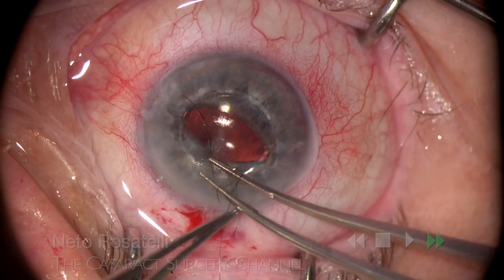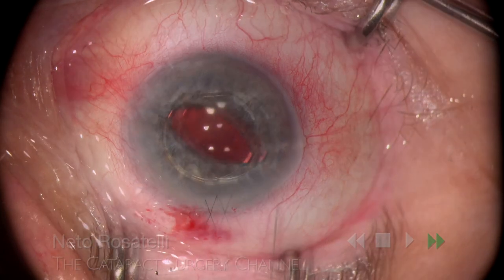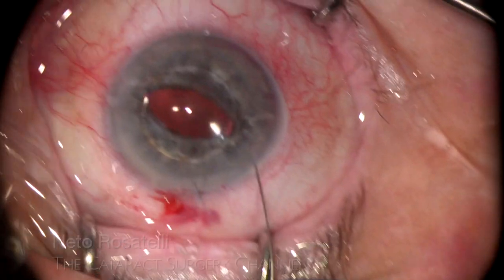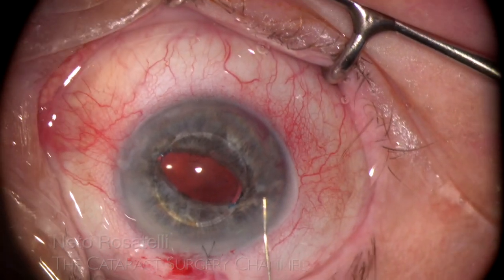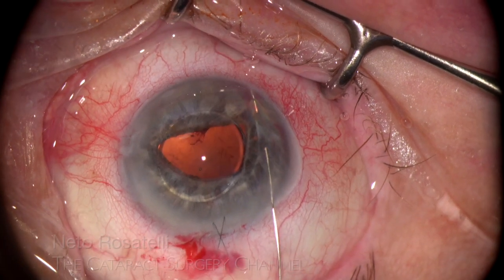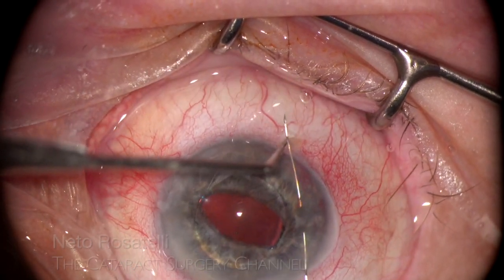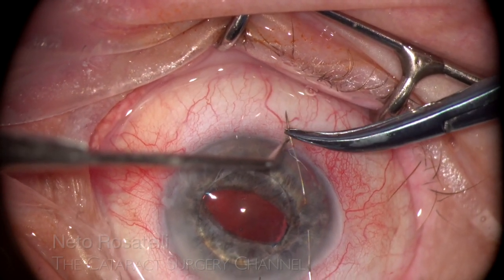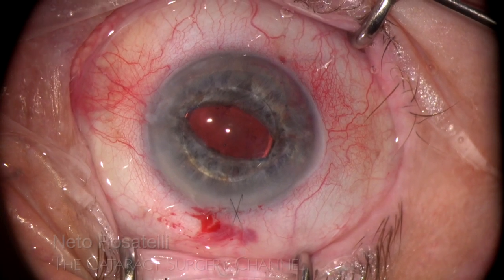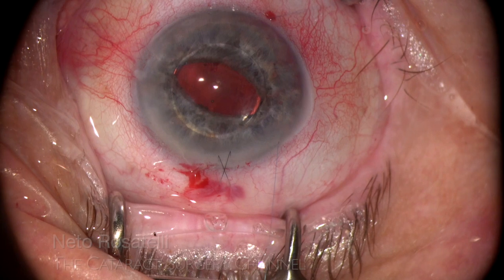Now for the iris fixation. The IOL already is at the intended position. Fixation sutures will be placed at 3 and 9 o'clock. I am passing a 10-0 prolene with a straight needle, going from limbus to limbus and engaging the haptic from behind with a moderate iris bite in its mid-periphery. By tenting up the iris, I check if the bite is adequate and proceed to exit at the limbus, a Kuglen hook helping to stabilize the eye. These placement landmarks are very important to ensure good IOL centration and a round and functional pupil. Care is taken when retrieving the needle and maintaining it at the iris plane to prevent iris damage. The straight needle is somewhat clumsy, but easier to pierce the cornea than the conical curved kind, and I prefer it.